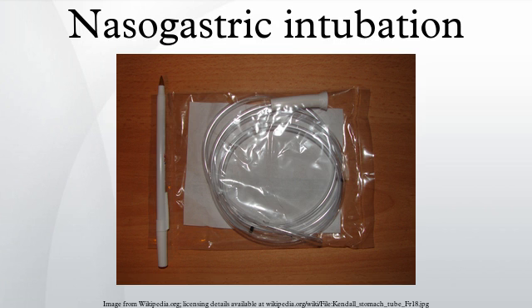Contraindications. The use of nasogastric intubation is contraindicated in patients with base of skull fractures, severe facial fractures especially to the nose, obstructed esophagus, esophageal varices, and/or obstructed airway as well as clotting disorders.